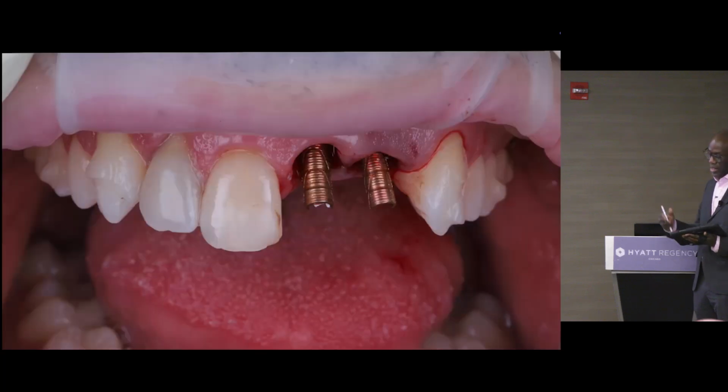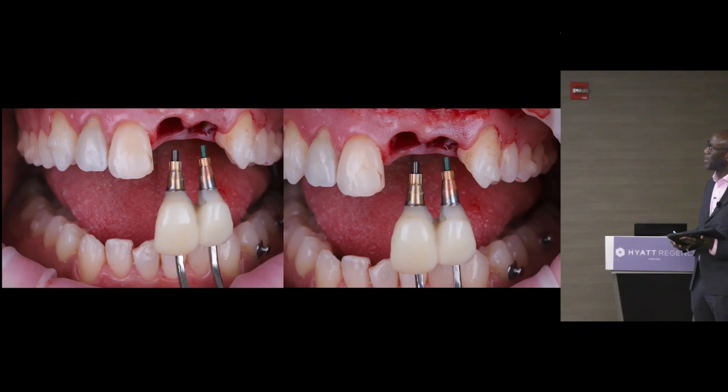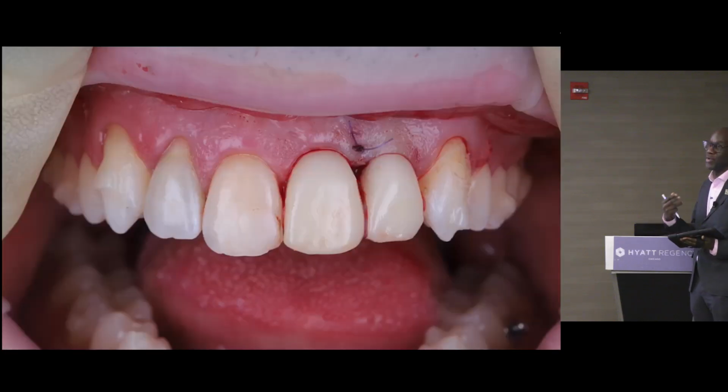So again, we can see here the tie bases. This is them picked up. This is them at the time of fit. And what would have been a really quite difficult case to do, we've simplified by having workflows that allow us to actually go through and treat the patient in that way.